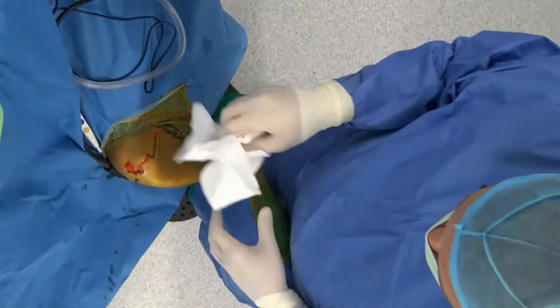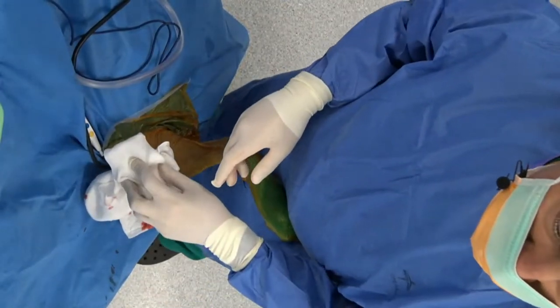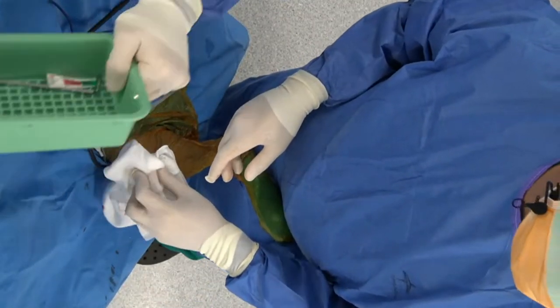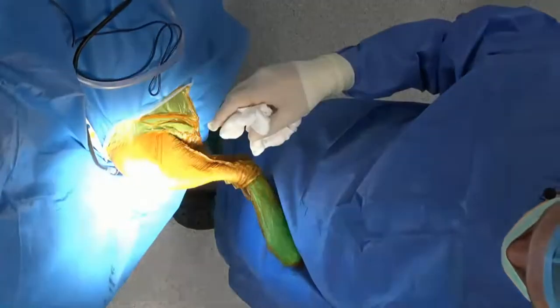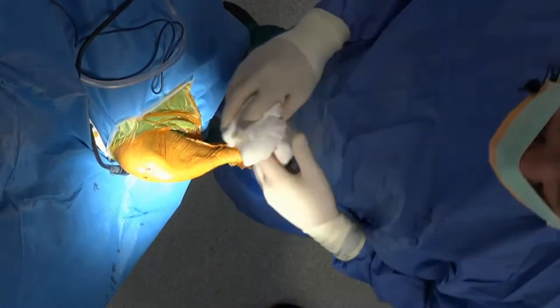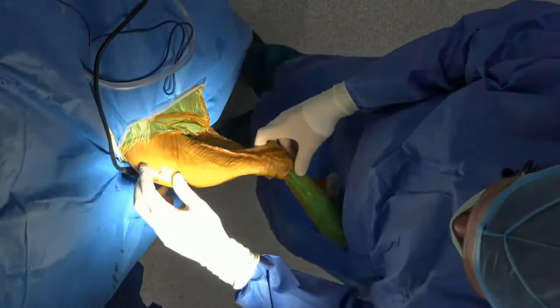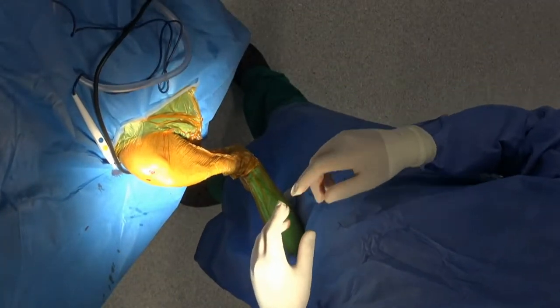So we'll push ahead. We are here. My name is Dr. James Simcock. We're at South Paws in Mornington. And we're going to do a CBLO today, which is a little bit different flavour from the TPLOs that we would typically do for managing cruciate disease. It's a golden retriever that's 11 months old, has bilateral problems.